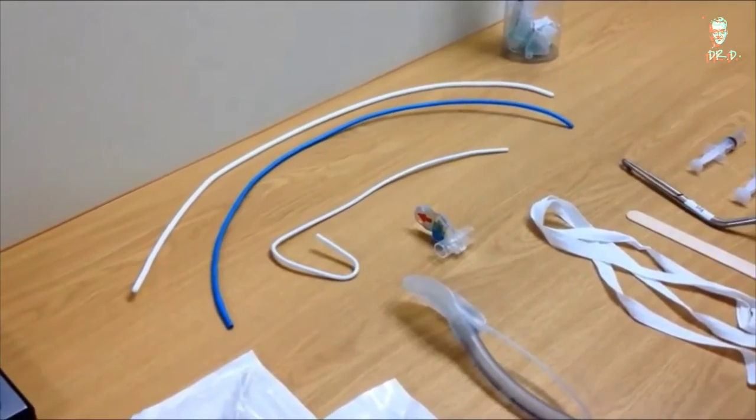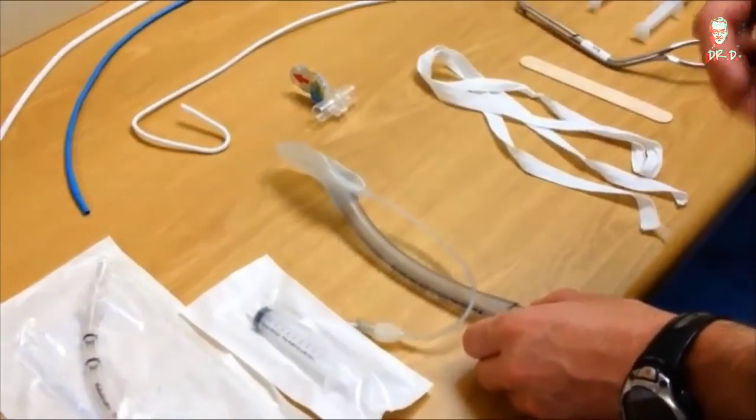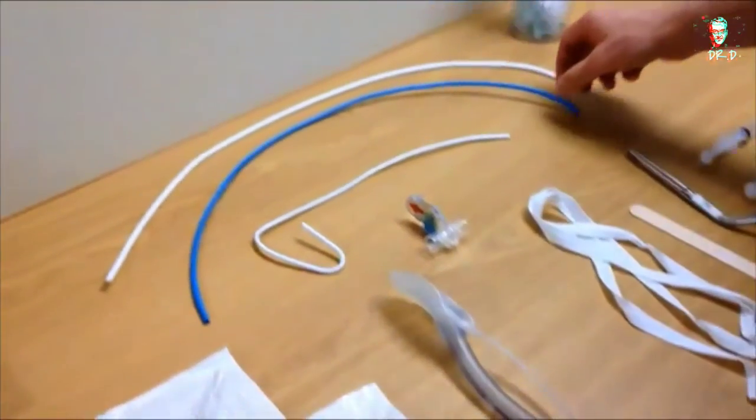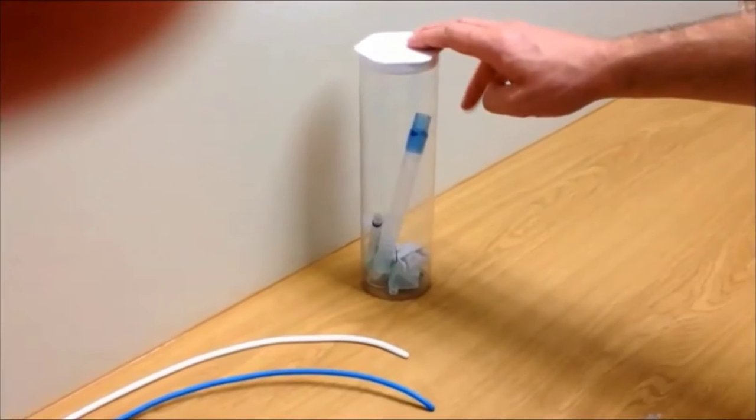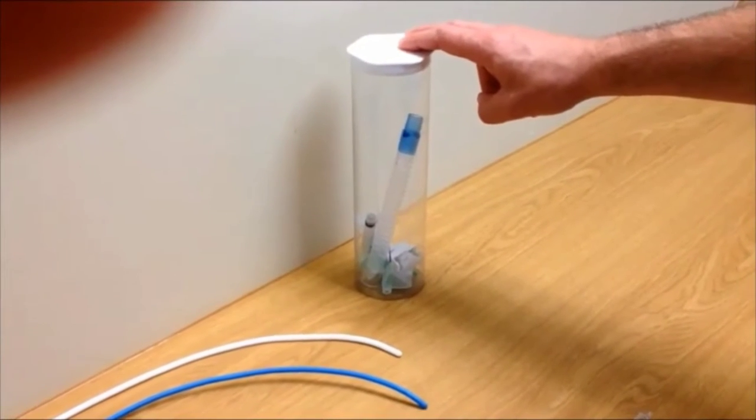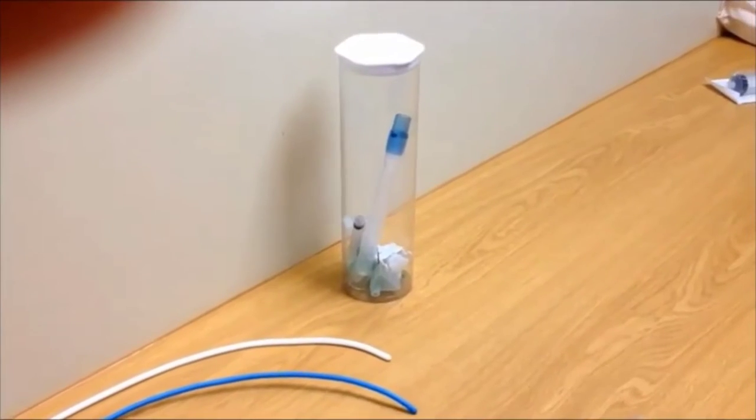We suggest a minimum of the following: a supraglottic device such as a laryngeal mask airway, a selection of long stylets or gum elastic bougie, and a surgical airway kit. In this case a tracheostomy kit. You could also have a surgical cricothyroidotomy kit available.